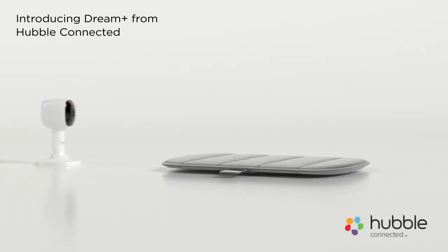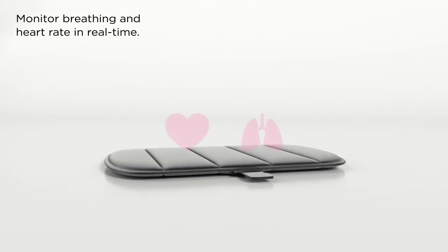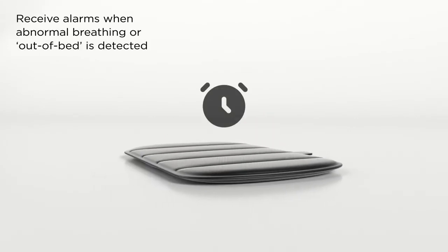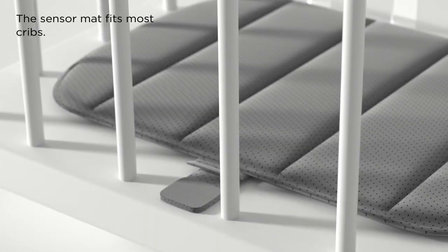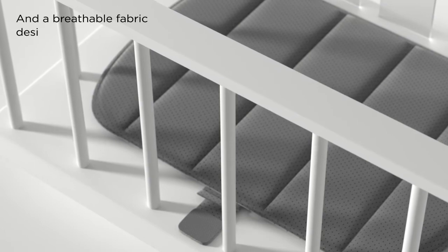Introducing Dream Plus from Hubble Connected. Monitor breathing and heart rates in real time. Receive alarms when abnormal breathing is detected. The sensor mat fits most cribs, has up to five days of battery life, and a breathable fabric design.